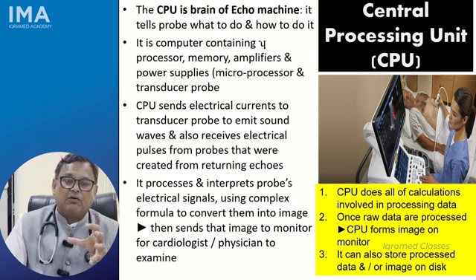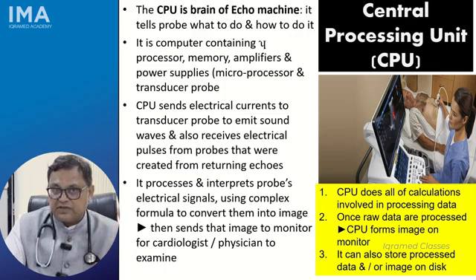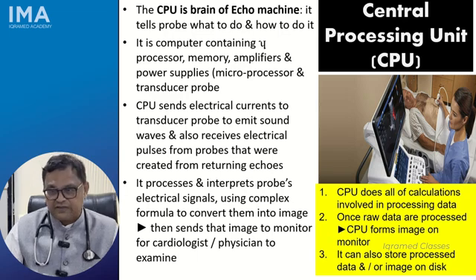So this is how the whole thing works. Later on, the image on the monitor, you could even store it, keep it as processed data, or you could store the image on the disk as well.